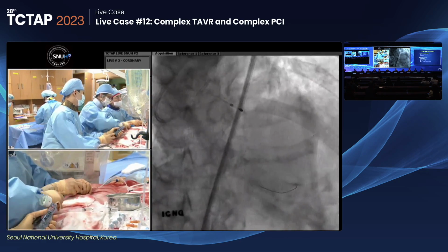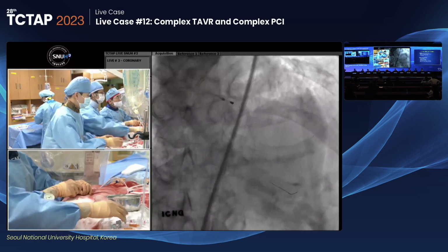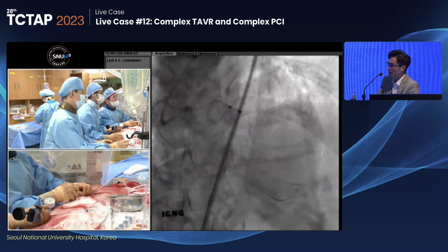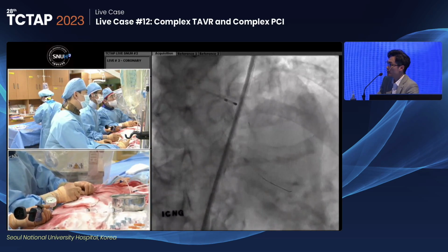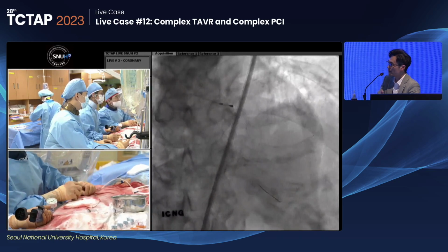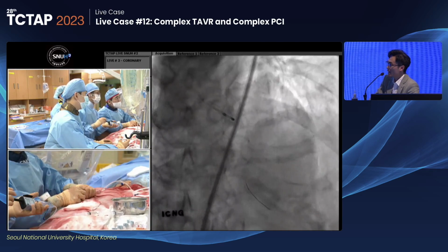Professor Park, in Korea you don't have Impella. For example, this patient's EF has improved a lot to 40, but if her EF had not improved with the index RCA procedure, and you had to deal with what the angiogram looked like today, would you put in ECMO?